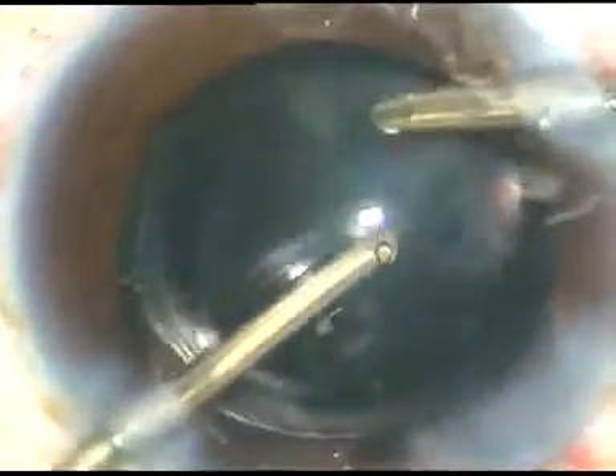Now the viscoelastic substance that has been used for implanting the lens is being removed. The irrigation and aspiration is being carried out simultaneously by this very simple Simcoe cannula. Here is the irrigating probe of bimanual I/A. The irrigating probe goes into the capsular bag behind the lens and the bag is thoroughly irrigated. Irrigation and aspiration are used together for thorough cleaning of viscoelastic substance.